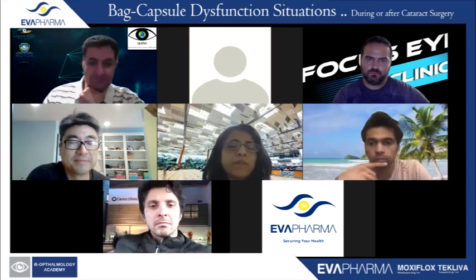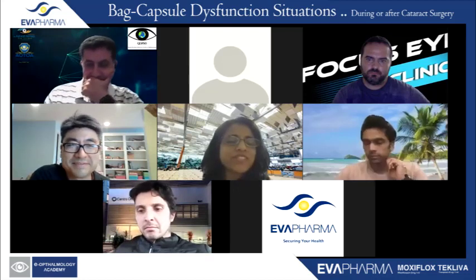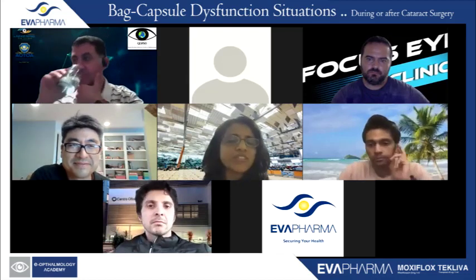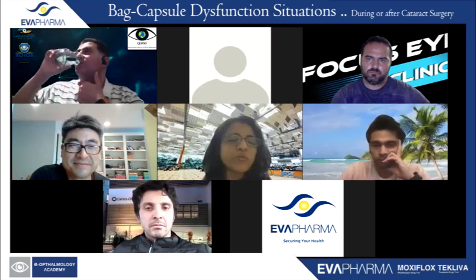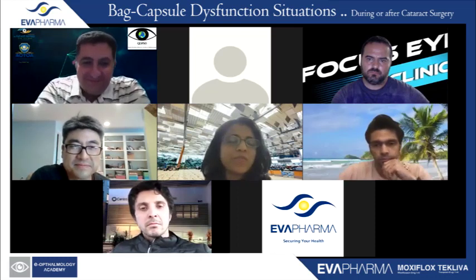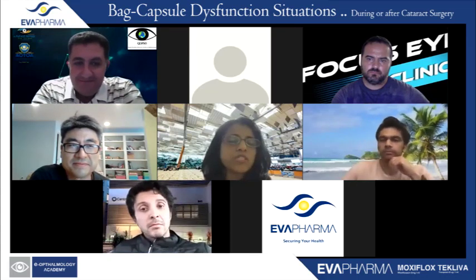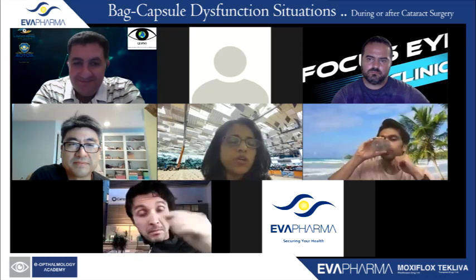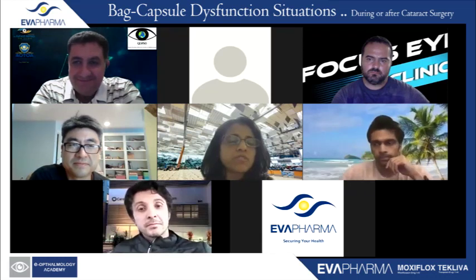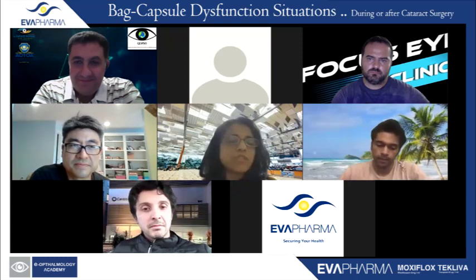Susan? Brian, yeah, congratulations, Brian. First of all, that was a terrific presentation, and it's a testament to your surgical skills, the way you broke that procedure down and made it look so simple. Like Ashvin said, I really am so impressed with that now, because I always used to think this is such a difficult technique to do. But your trailing first really seems to be a complete game changer, in that it makes it look much easier now.